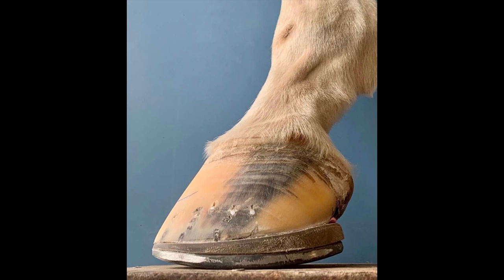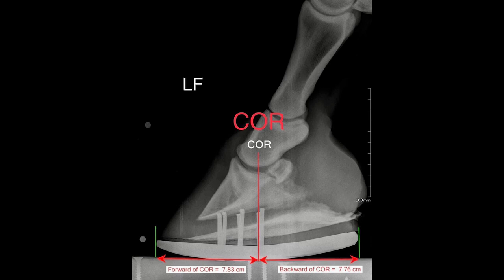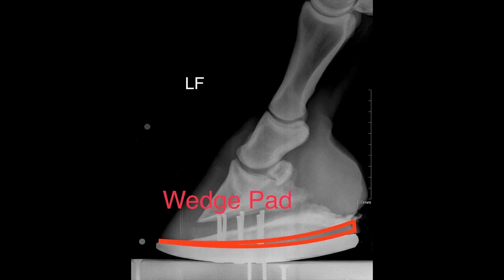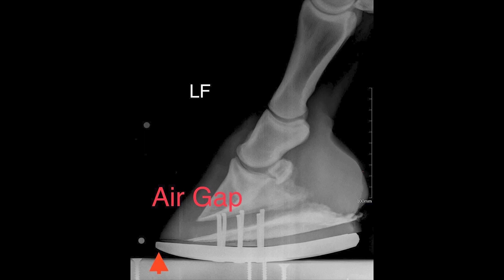Some of the important aspects of the application of a full roller shoe are: center of rotation must be directly above the belly of the shoe. The shoe should be radial from front to back. I always use a wedge pad unless I'm dealing with a club foot. There should always be an air gap under the toe of the shoe. If this is not the case, you might need a higher grade roller and or more wedge.